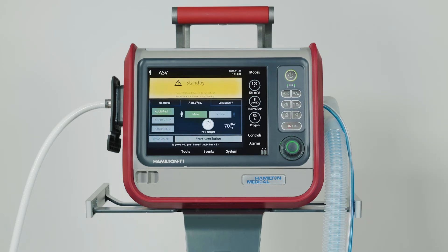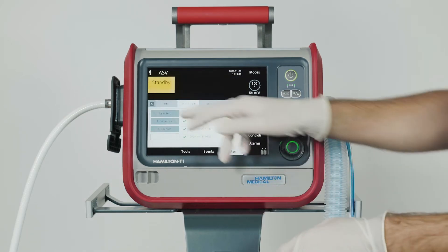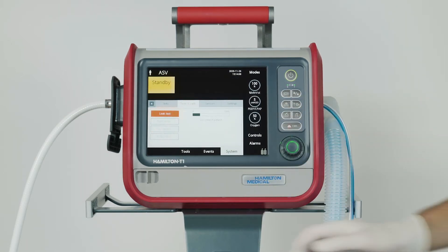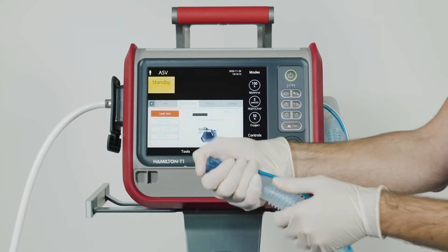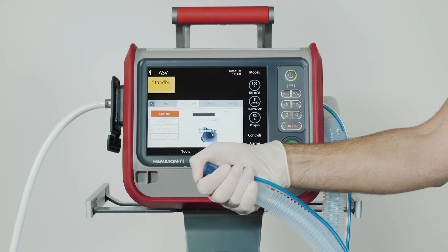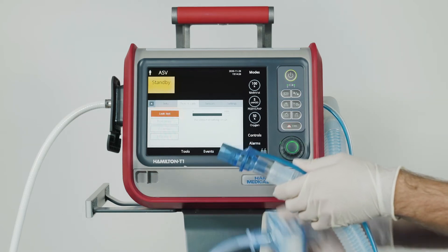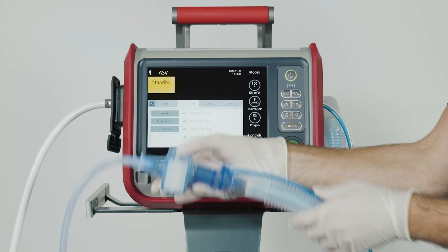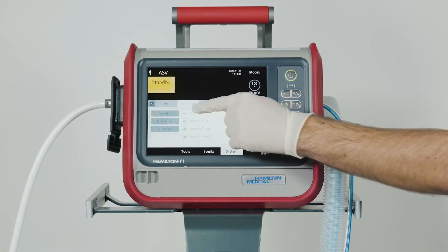To do the leak test, choose this function and then follow the instructions on the ventilator. When the message saying 'Disconnect patient' appears on the screen, you should disconnect the test lung. When you see the message 'Block breathing circuit', block the opening. Once the leak test has finished, the message 'Reconnect breathing set' will appear. Now you can connect the breathing circuit again. When the test has been completed successfully, a green check mark will appear in the box.